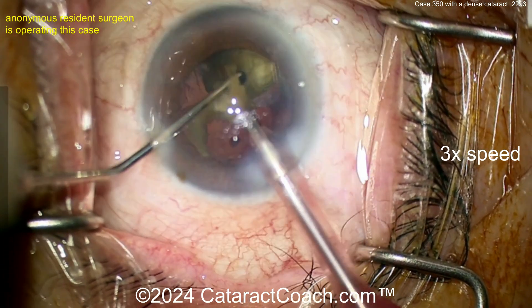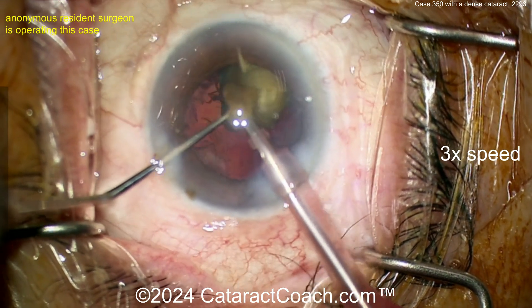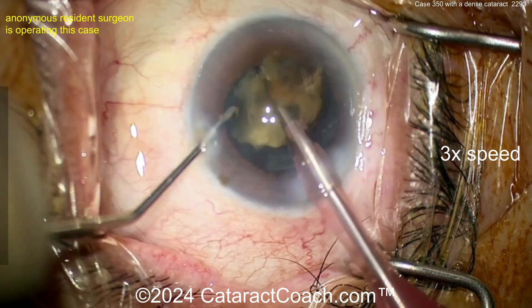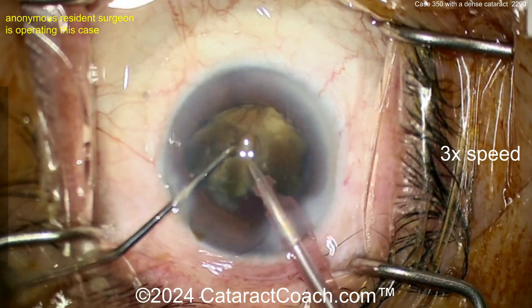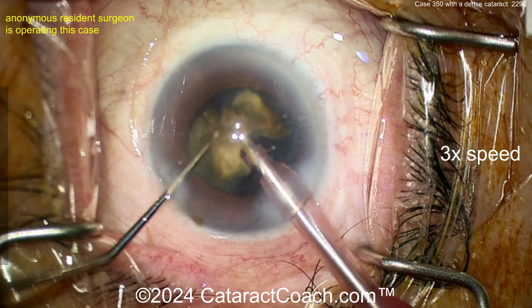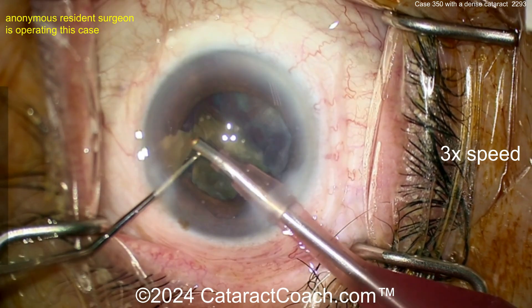Taking these pieces out nice and easy. Remember, as the last pieces come out there's very little or no cortex weighing down the capsular bag — be careful that the capsule doesn't come up too. For the last piece I usually put the smooth back side of my chopper behind the probe just to prevent the posterior capsule from coming up. I don't aim the sharp tip of the chopper toward the posterior capsule — I use the back end. The piece comes out nice and easy.